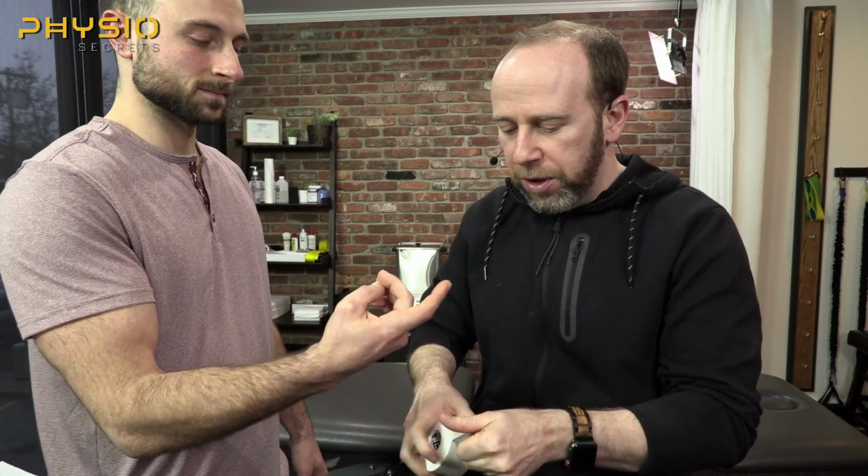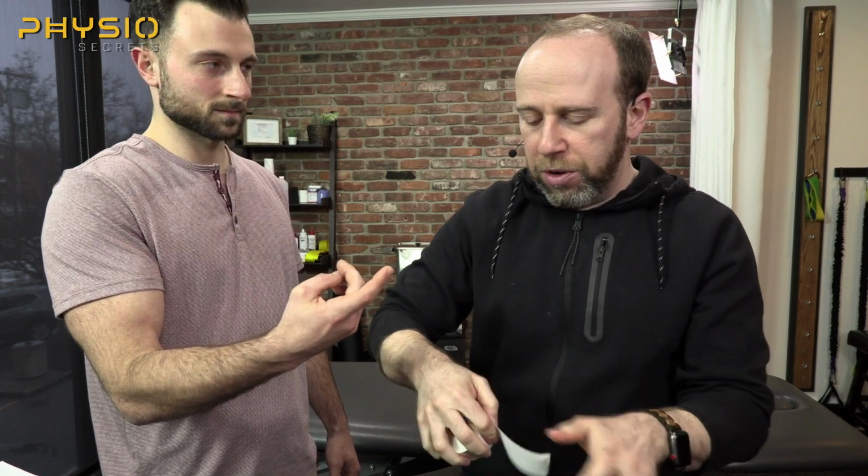So I'm going to do this really crudely just so you guys can see the concept here at work. So take my athletic tape, I'm going to get a couple little strips, I'm going to set those down, and sometimes it's helpful to prep what you think you need beforehand. So I'm going to do that. So I have anchors, I have my finishers, which are going to go at the very, very end. And then I'm going to have my little straps that are actually going to block the motion, which I'll make a little bit shorter. Good.